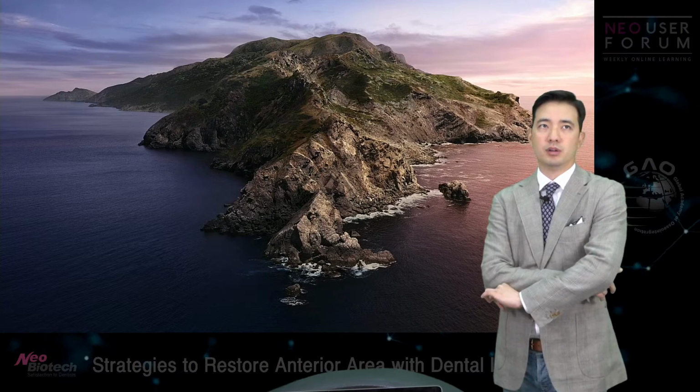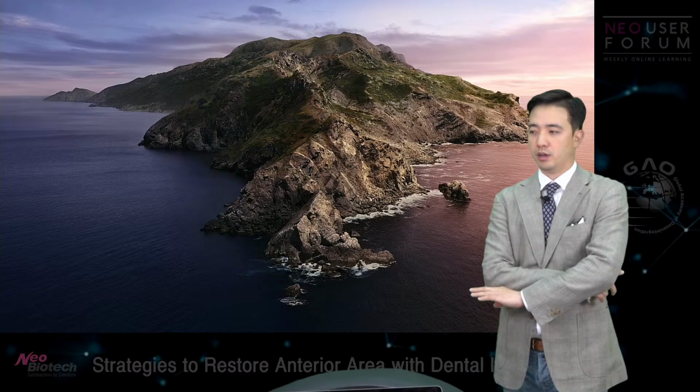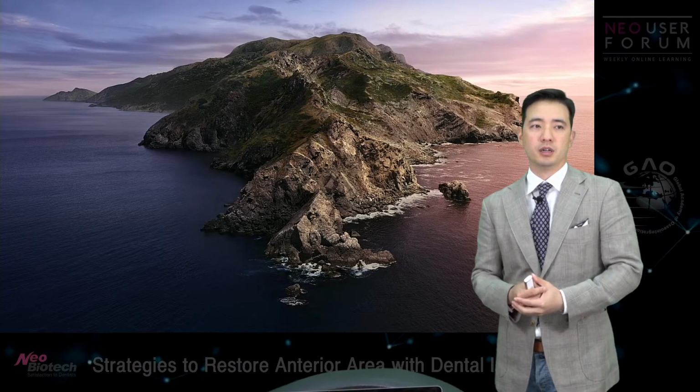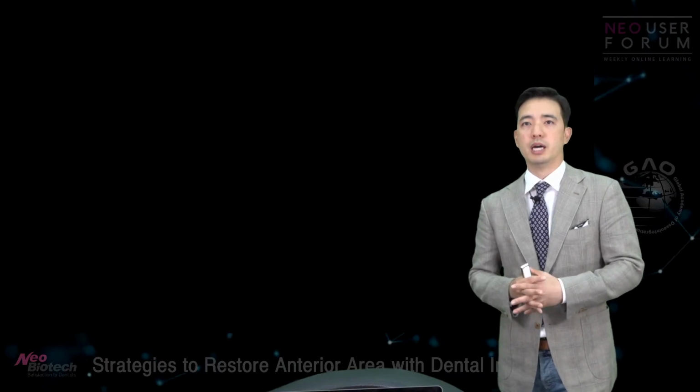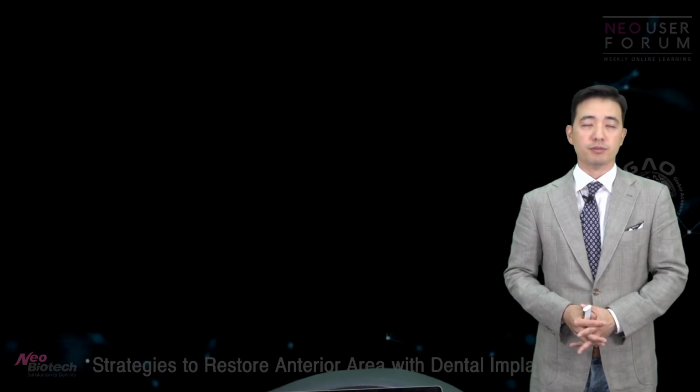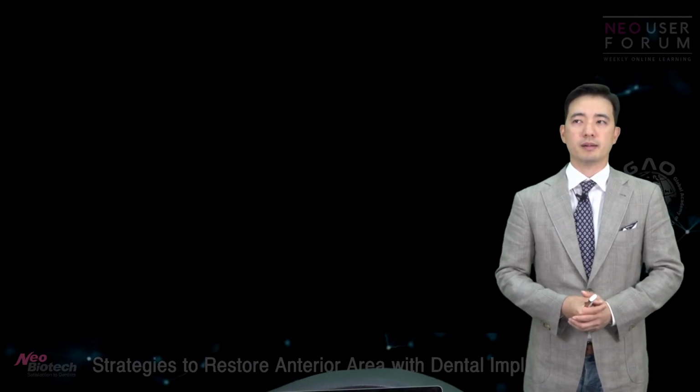If you feel that the patient has a really good anatomical situation without any infection, and for cases like a fractured tooth, then you can try.